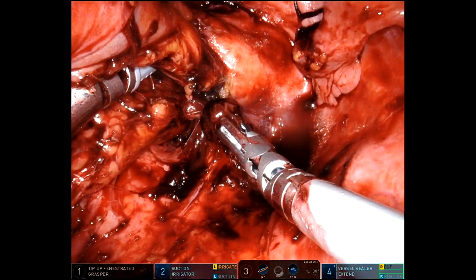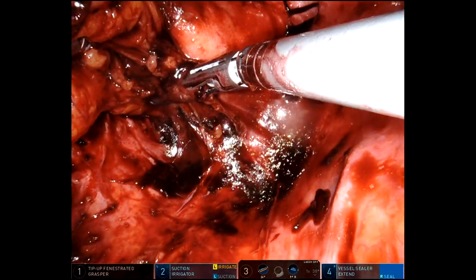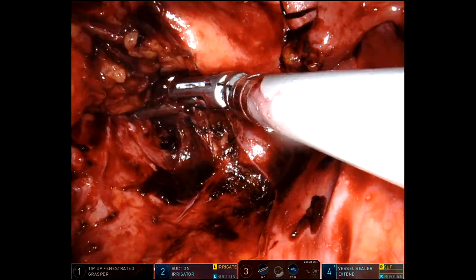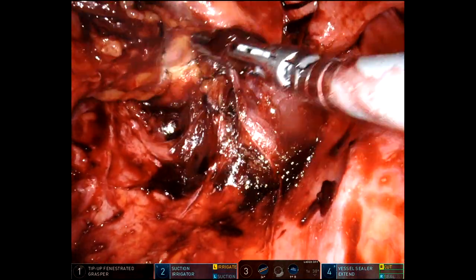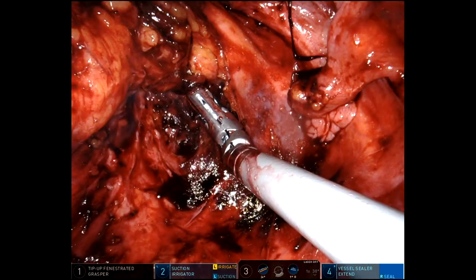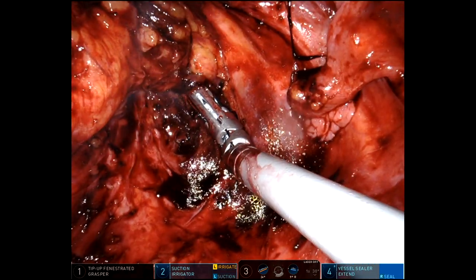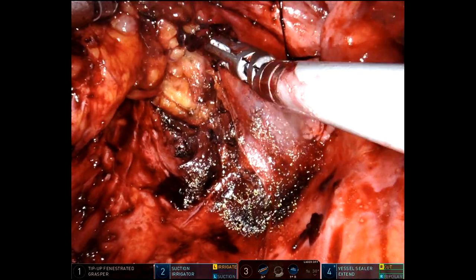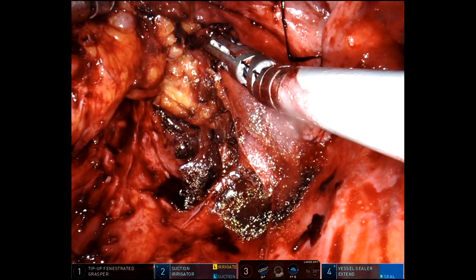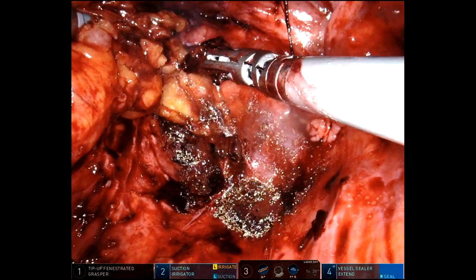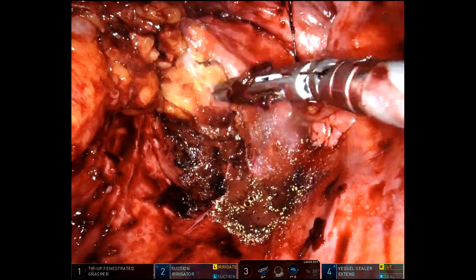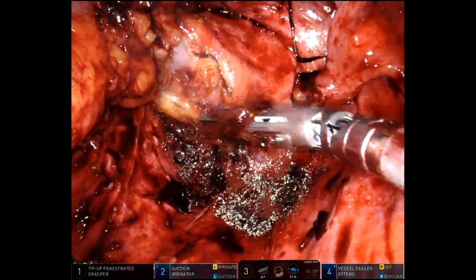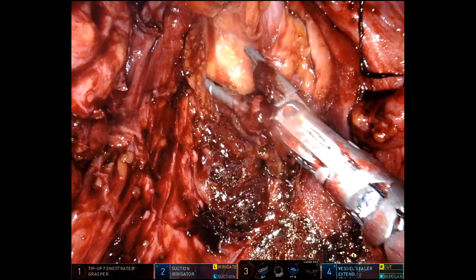Now I've finally gotten that loop of sigmoid out of the pelvis, so I'm going to go ahead and take my distal rectal mesentery and clean off where I want to transect distally. This is actually much lower than you would for a standard sigmoid resection — the anastomosis ends up being just above the peritoneal reflection. It was necessary to take the upper rectum as it was really scarred in and damaged with the disease.